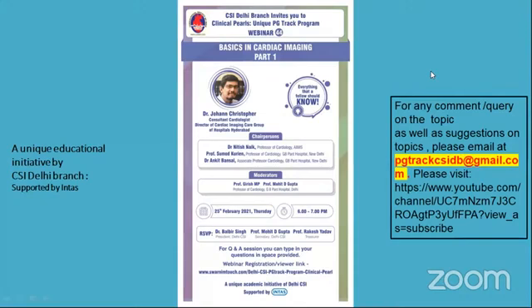You get it done at the same center. So the PET MR is an extremely great tool for not just sarcoid, but all inflammatory myocarditis conditions, including TB, sarcoid, myocarditis, and so on and so forth. So we send our patients to a PET scanner away. These patients have heart failure, they have recurrent VT, they're fairly sick. So a PET MR can clearly take away the logistical jam very easily. But its role in cardiology is fairly limited for various reasons.